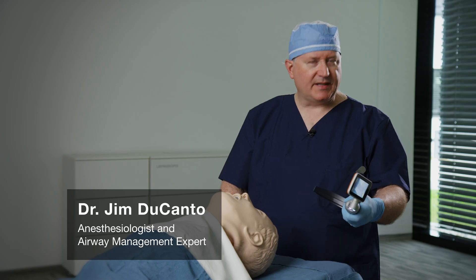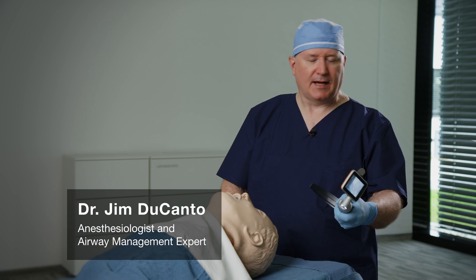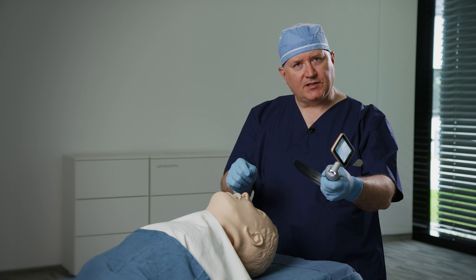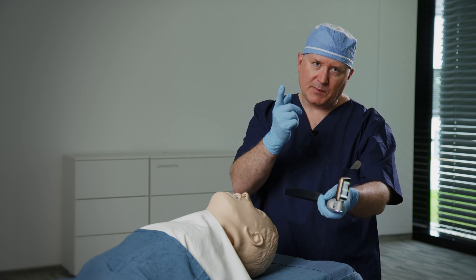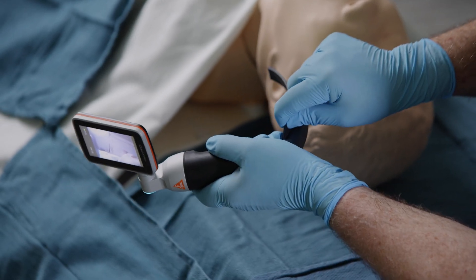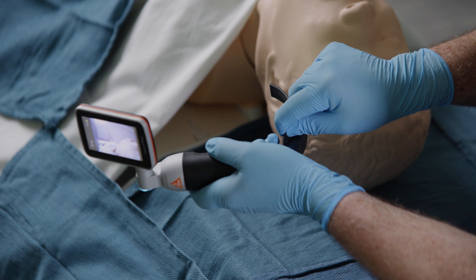What I'm going to be talking about is something I call the micro skills of laryngoscopy, in which I position the laryngoscope when it's in the patient's hypopharynx using two hands. I use my free hand to actually pinch the flange in order to control depth and laterality of the laryngoscope.